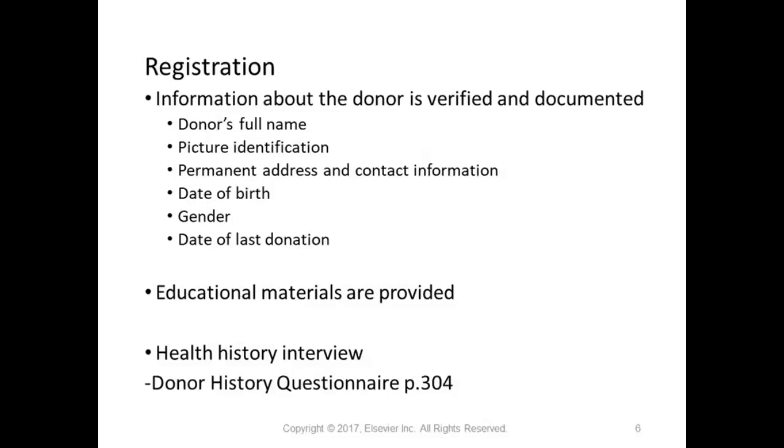All this is now, of course, computerized, so the donor sits in a room and answers all these questions. Your book has 48. There may be a few more. I'm not sure if these are the exact questions that match what Vitalant has, but it's pretty close.